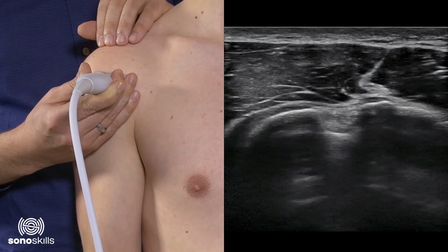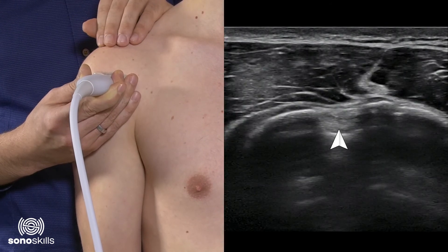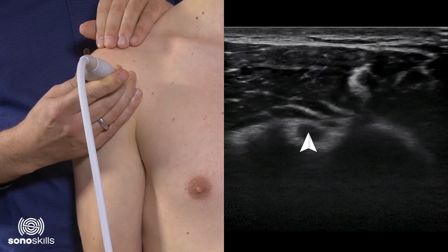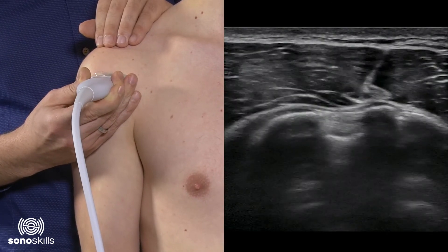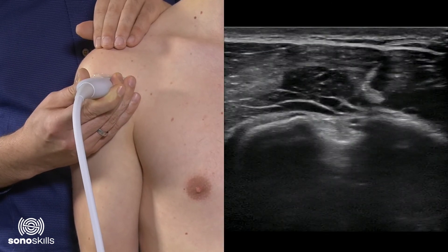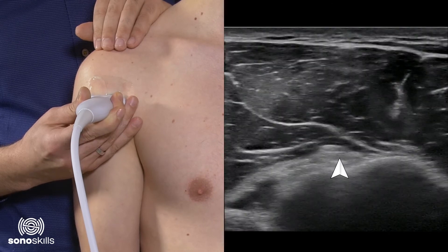Following the biceps down, you will have to be careful that the echogenicity of the biceps is correct and stays hyperechoic, because a small change of transducer angle already changes the echogenicity. If you lift the transducer a little bit the image gets dark, but with a perpendicular scan you will see a nice hyperechoic depiction of the biceps and the other structures. So keep the tendon nice, bright, and wide on screen.